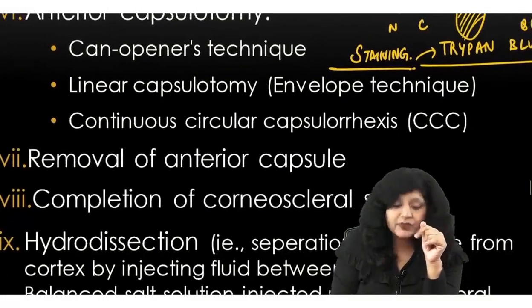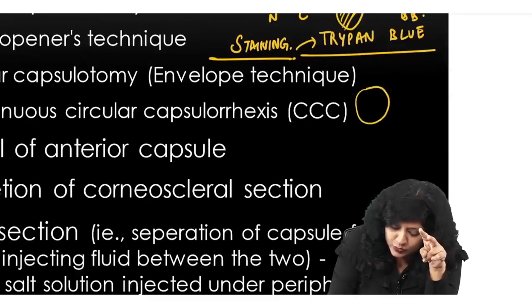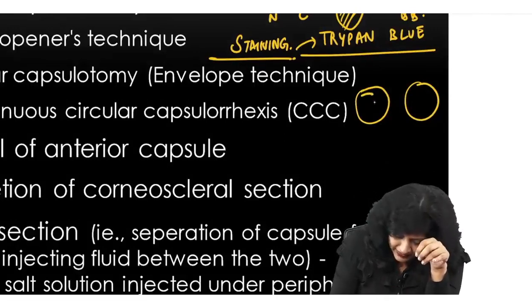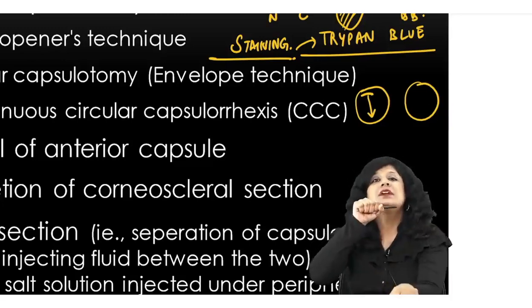In that we are using two techniques. Either we can do the can opener technique. I am giving a nick here, and then I am trying to pull it off. This is your can opener technique.